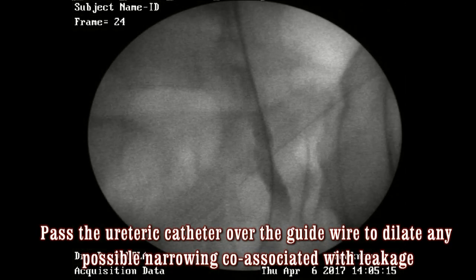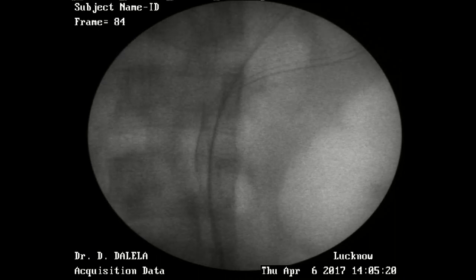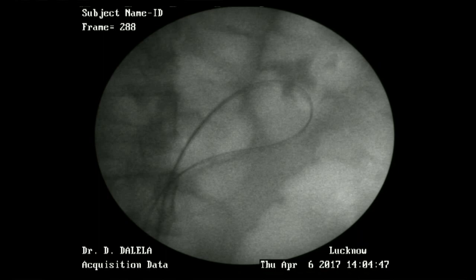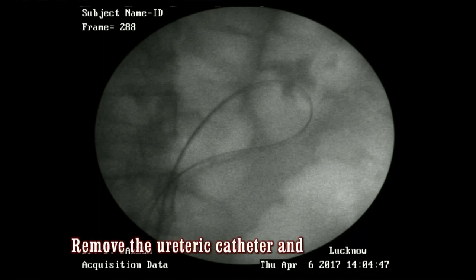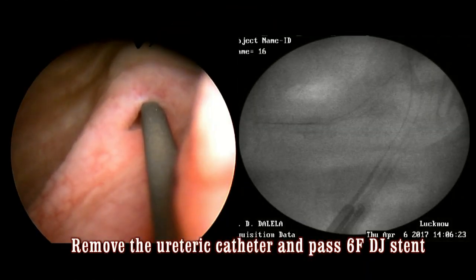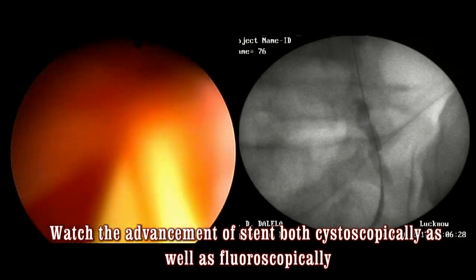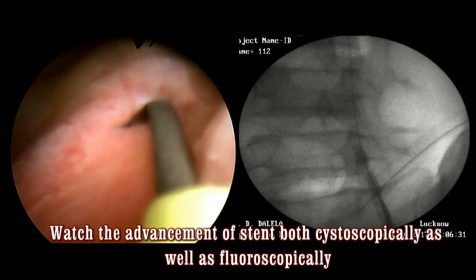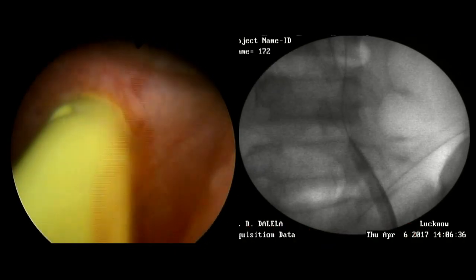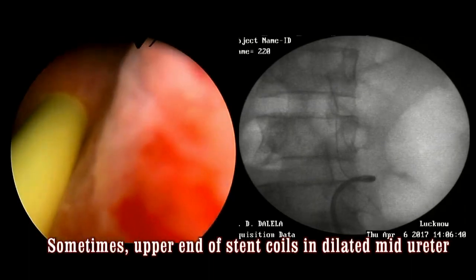Then you pass the ureteric catheter over the guide wire so as to dilate any co-associated narrowing in the ureter at the site of leakage. Having done that, you take the ureteric catheter out and then pass a 6 French double-J stent over the guide wire. As you pass the stent up into the ureter, you should watch the movement and advancement of the stent tip both cystoscopically as well as fluoroscopically.